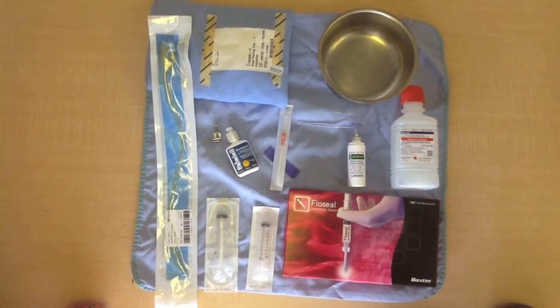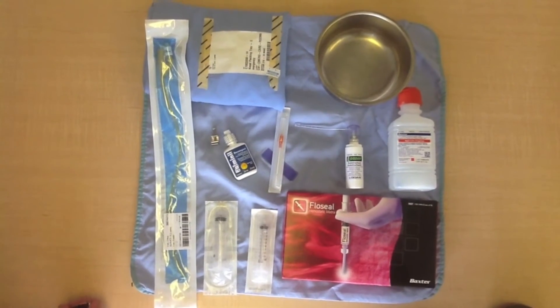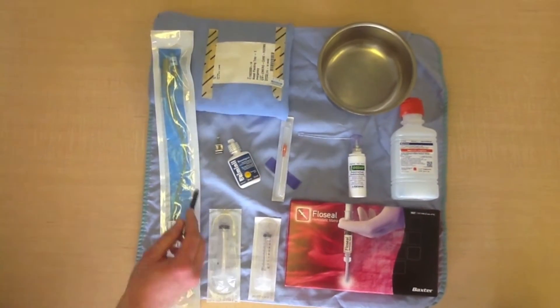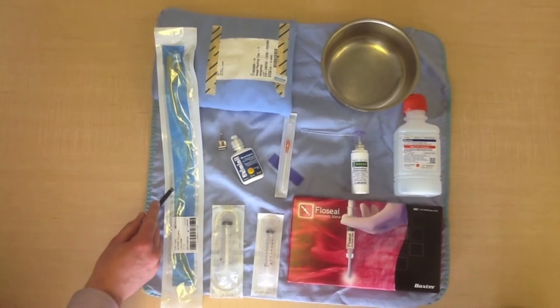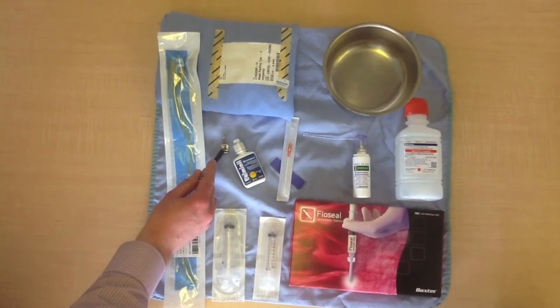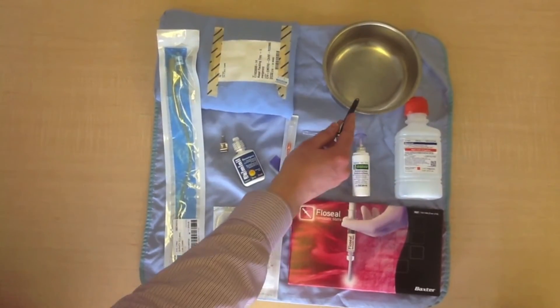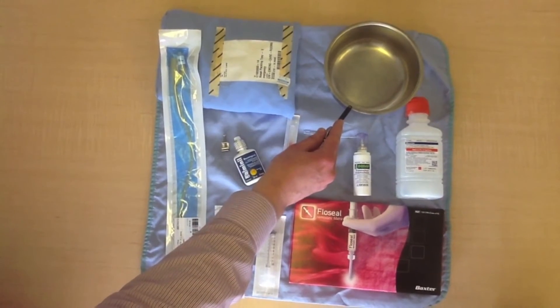There are a number of items needed in order to treat a patient with posterior epistaxis using the flow seal treatment technique. The first is a package of flow seal. You also need a nasal packing tray, a 12 French Foley catheter, and a nasal clamp for the catheter, which is optional. Sterile saline and a bowl to put it in are also needed to rinse out the excess flow seal at the end of the treatment.